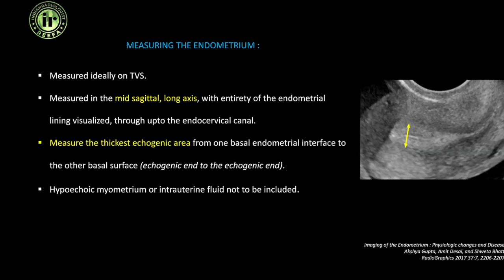How do we measure the endometrium? The ideal technique is a transvaginal scan, but for patients in whom we cannot do that, we can proceed with a transabdominal scan. Either way, the measurement is done in the mid-sagittal plane in the long axis, and the entire endometrial lining needs to be visualized right up to the endocervical canal. We measure the thickest echogenic area — from one basal interface to the other basal interface at the widest part.